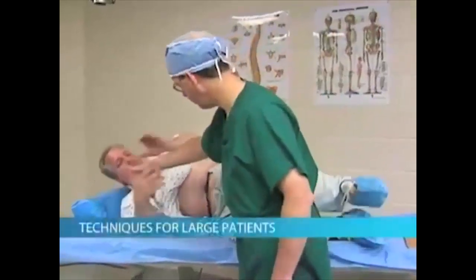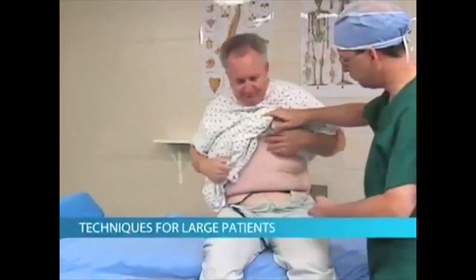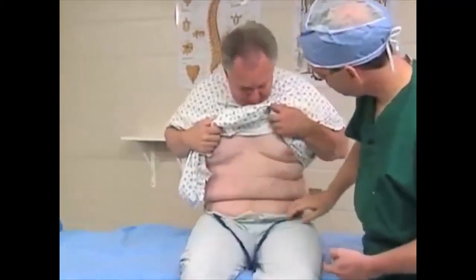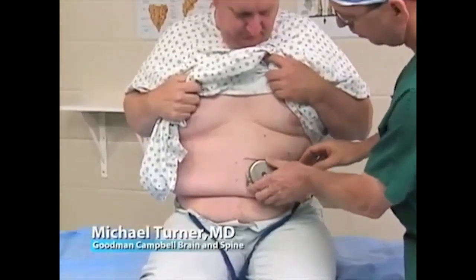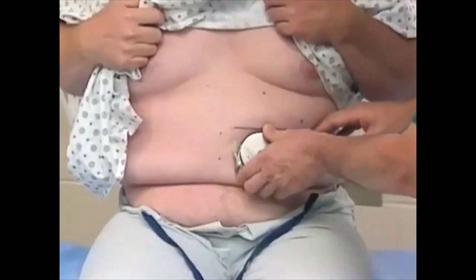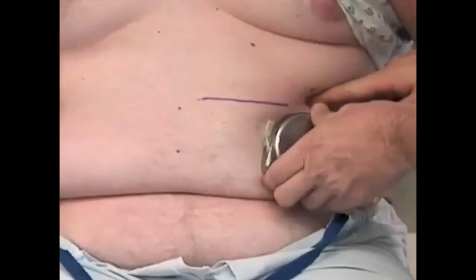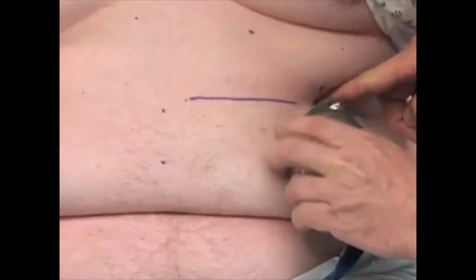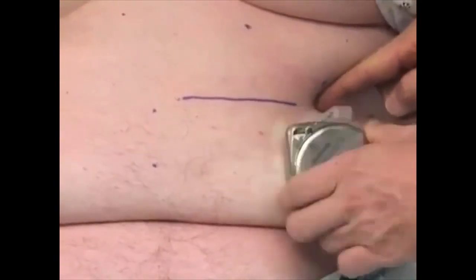Have you sit up and demonstrate some of the other changes when you sit up. And here he is sitting up, and again you can see what's happened. The pump now has to be located about here, even though it looks like there were other parts. If we try to move it over too far, here is the rib cage, and it'll be rubbing. Again, it's very important not to have the side port up. It will tend to rub against it.